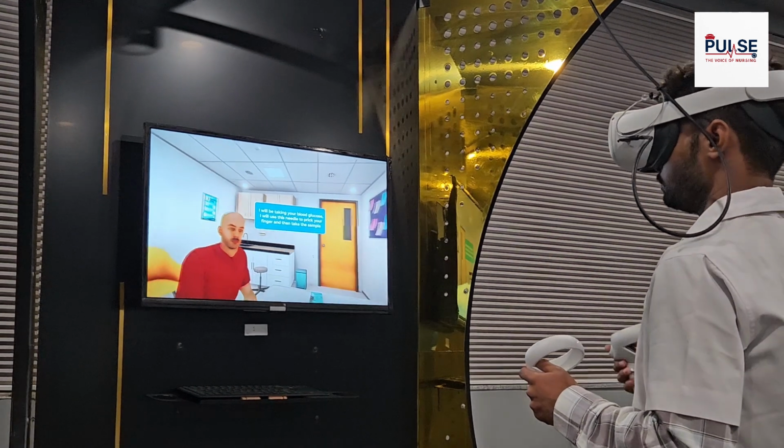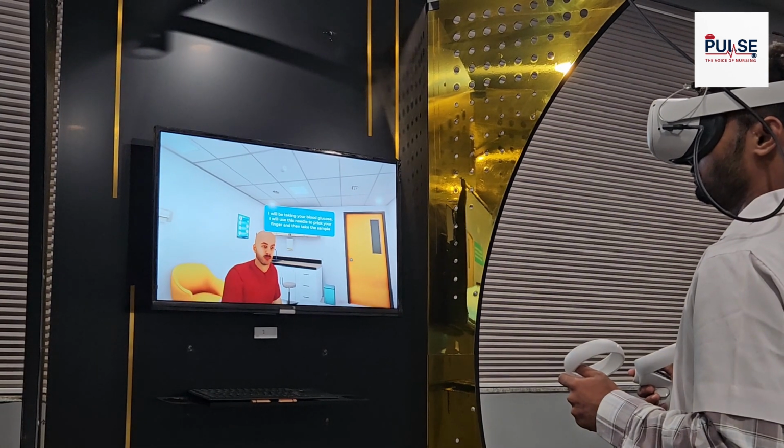I will be taking your blood glucose. I will use this to prick your finger and then take the sample.